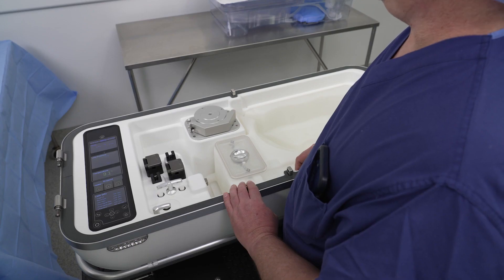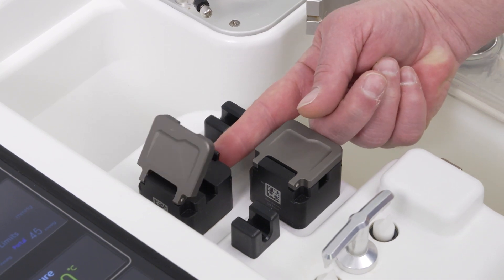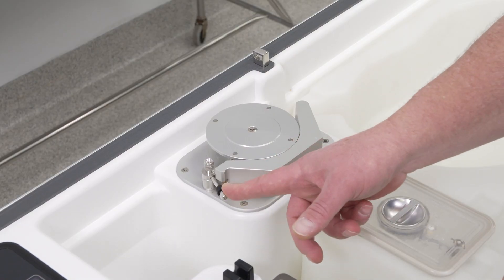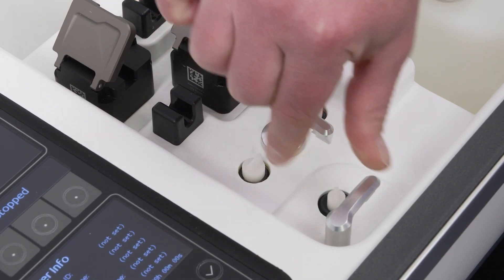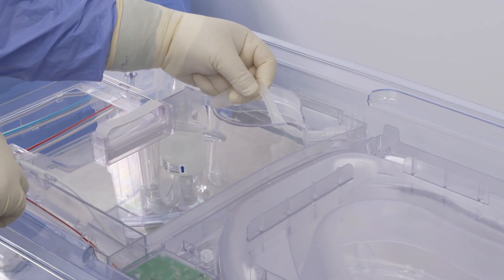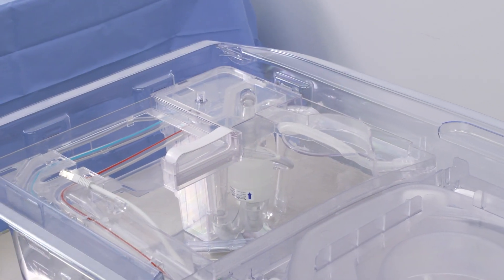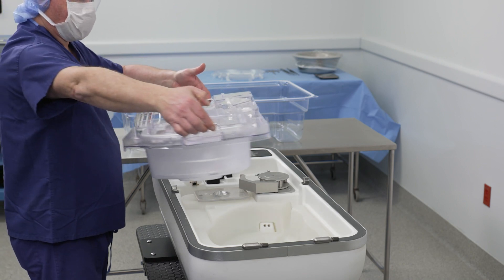Stage the Life Port Liver Transporter to receive the perfusion circuit. Ensure the flow sensor doors, pump head raceway, and locking arms are in the open position. On the perfusion circuit, position the pump tubing loop over the pump guard. Using the handles, transfer the perfusion circuit to the Life Port Liver Transporter.